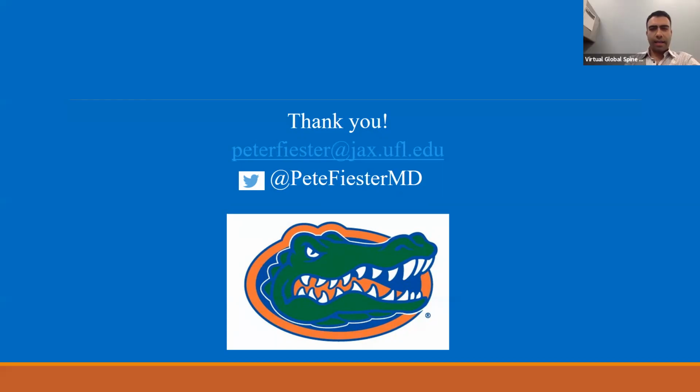Ali and Matt, thoughts on CTAs? It's actually a really good question, because sometimes I feel like we maybe do it a little bit too much. It's like literally any fracture at C2. It could be a little fracture of the body of C2, or a dens tip odontoid fracture. The ER typically gets CTAs for any one of those fractures. So I'm just wondering your thoughts. Is it protocolized at your institutions? Do you routinely get them?